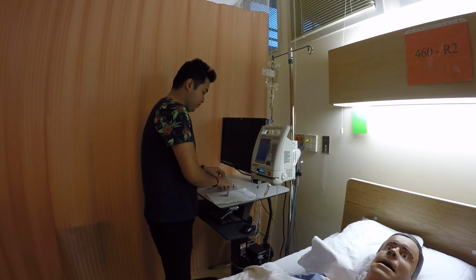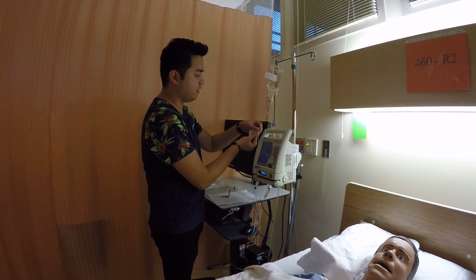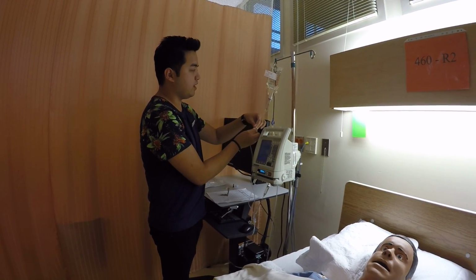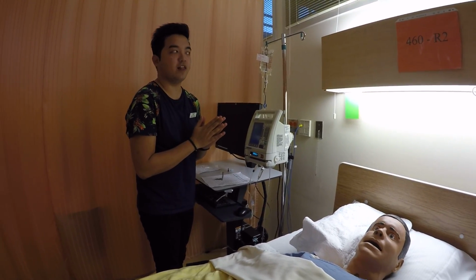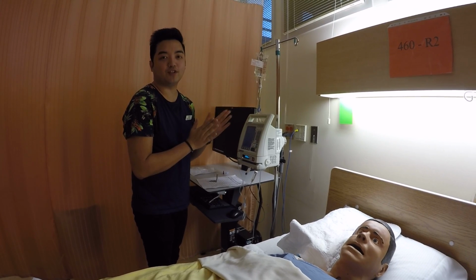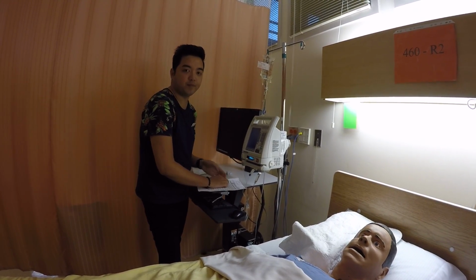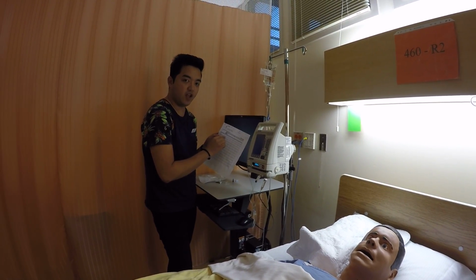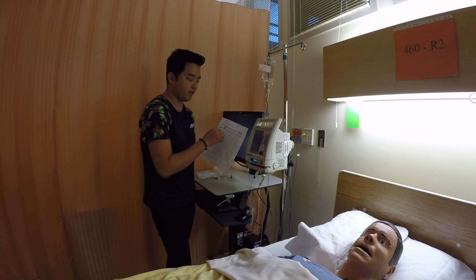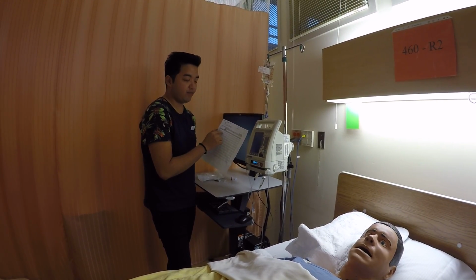And then make sure that we also put a label on the tubing that has the date and time of when we put it in, so that all other healthcare providers would know as well when to change the tubing. Okay, and then next thing to do is to document. So important thing is that we sign and date, we put the time and our signature of when we give the medication.